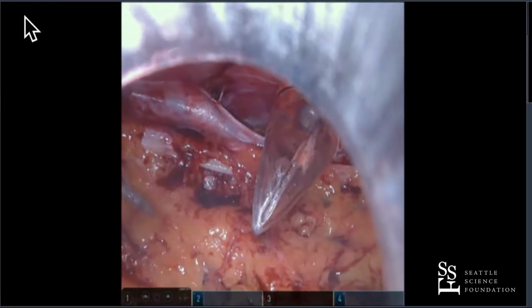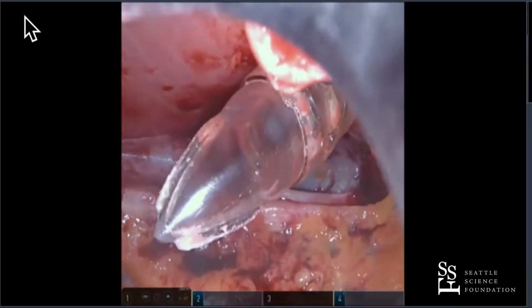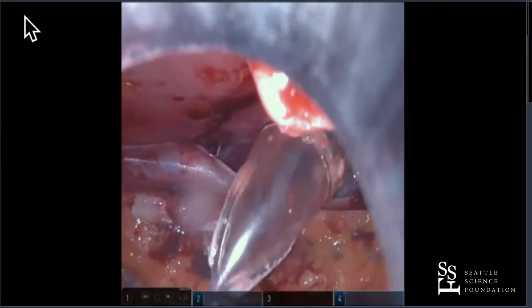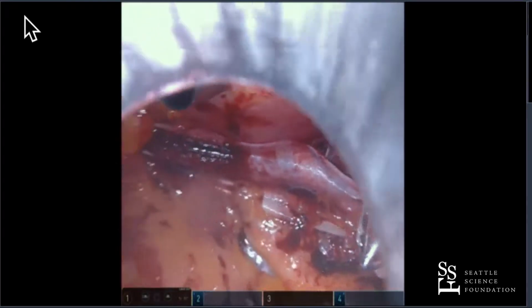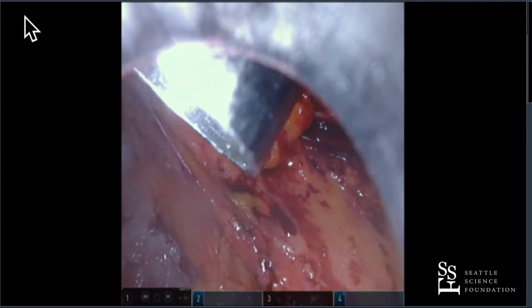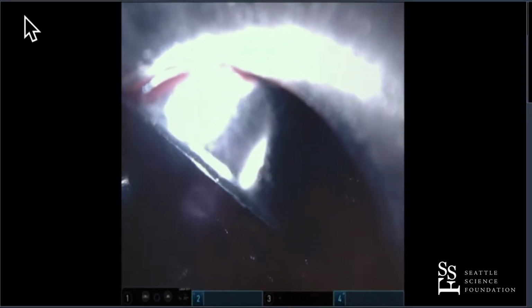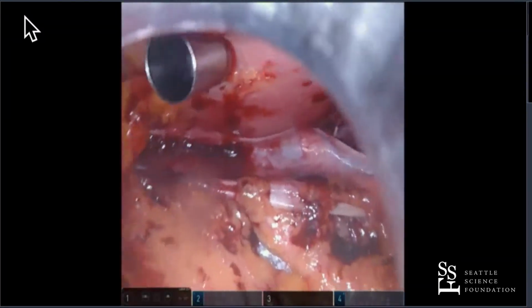And this is your air seal port, correct? Yeah, this is air seal. So we're going to go to air seal here. This is 12 millimeters. Okay, air seal mode, please. And then let's run the pressure at 10 today, okay? So we're going to run at 10 today. And that's the other nice thing about air seal, you can run at a low pressure.